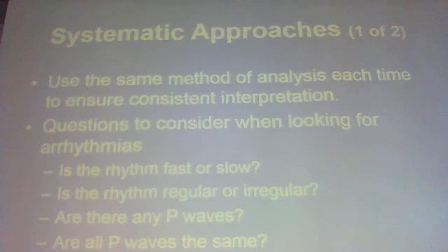So I got you some 12 leads coming around. No, it's a 3M product. It comes on like a tape roll. Like it's not four 3M, it's 3M. Yeah, you can get it in Boundtree.